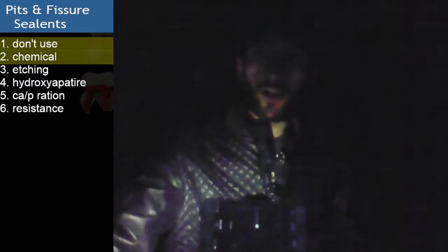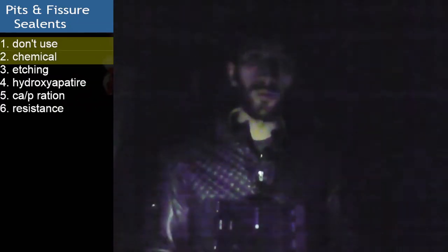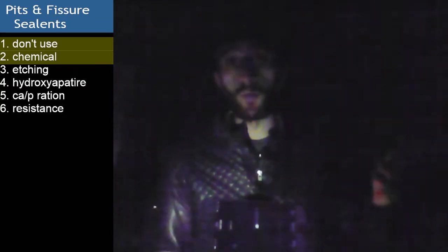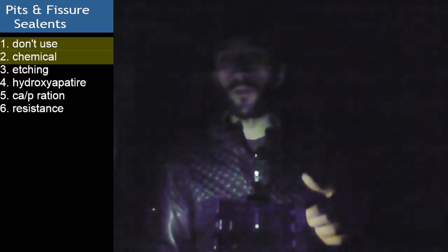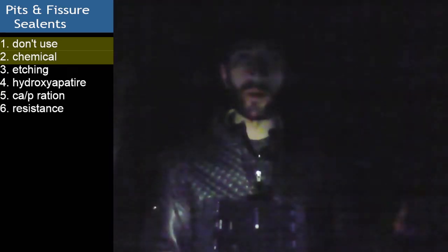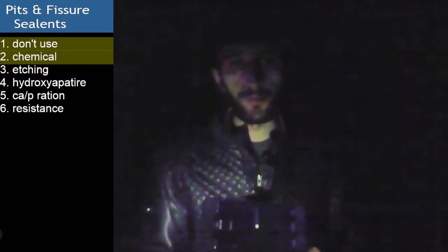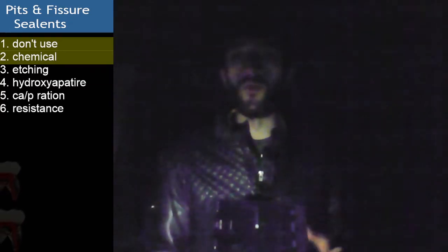We have two types of pits and fissure sealants. One is chemical, that is not recommended, and one is using light cure. And the light cure one is more recommended because it does not entrap bubbles that could cause problems in the future.